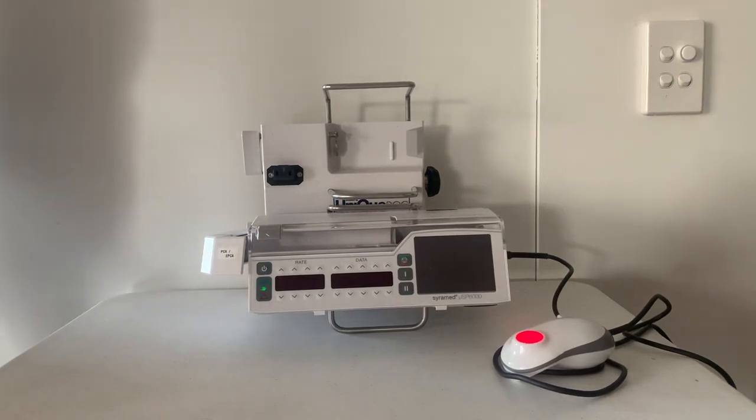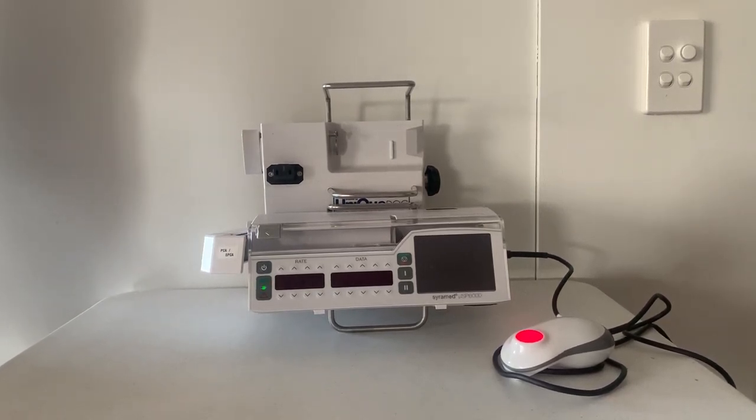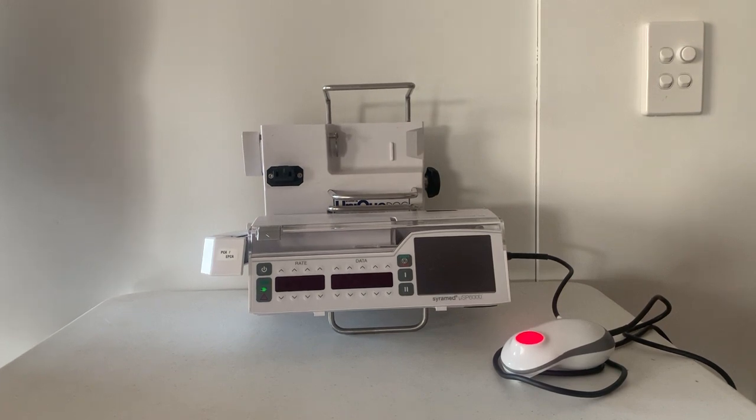The Syramed PCA pump from Archimed. It is safe, simple to use and a smart pump.